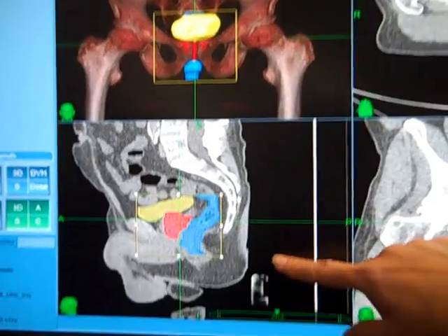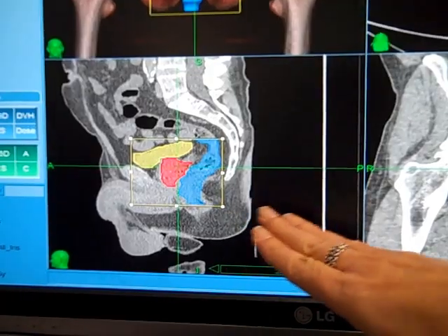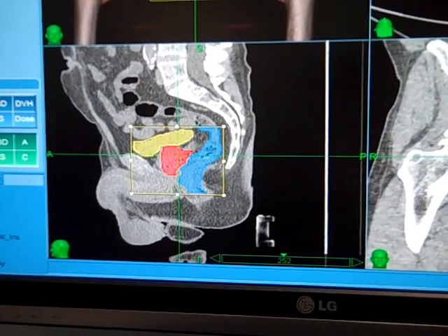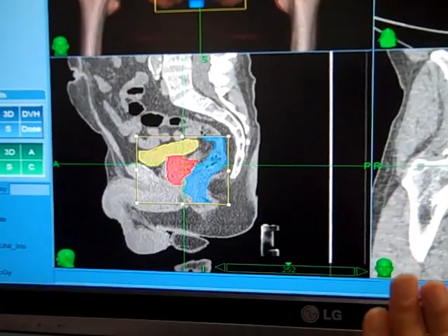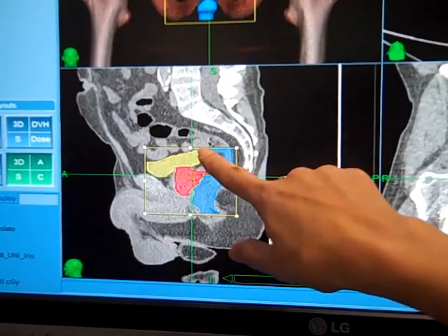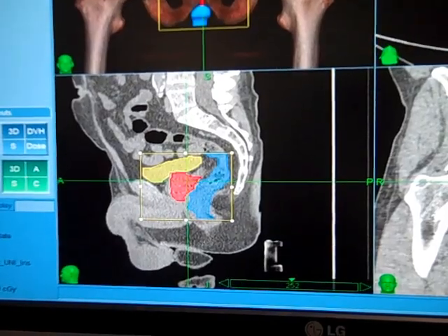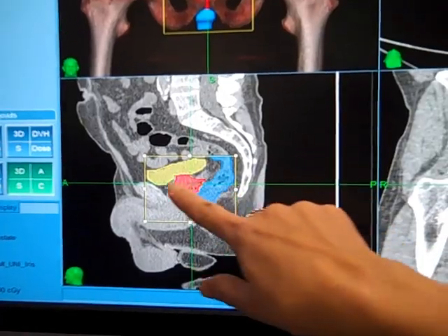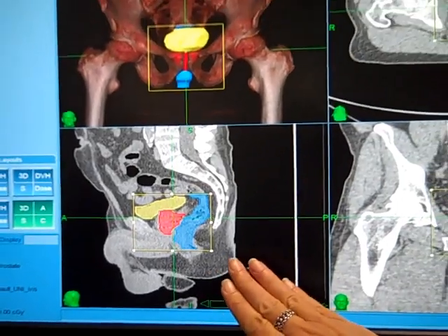This lower screen gives a better view of how these anatomic structures relate to each other. This is a side view of the patient, showing their backbone and tailbone. The blue is the rectum, the red is the prostate, and the yellow is the bladder. You can see how close these structures are to each other. It's really important that the treatment planning software understands the spatial relationships between these structures, so that the plan being created is unique to this individual patient.